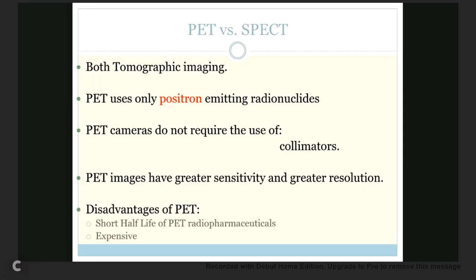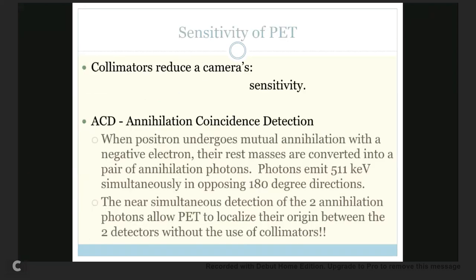So with the gamma camera, it's only going in one direction, which is upward. I mean, yes, gamma's going all over, but it's being detected upward, if that makes sense. Gotcha. I'm mixing it up with something else. Sure. Okay. All right.